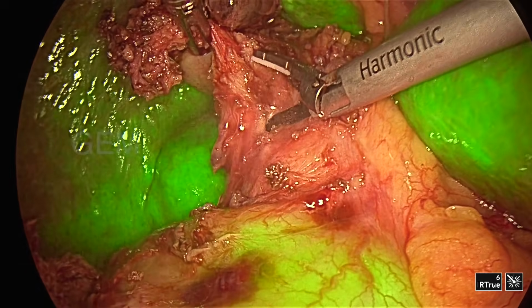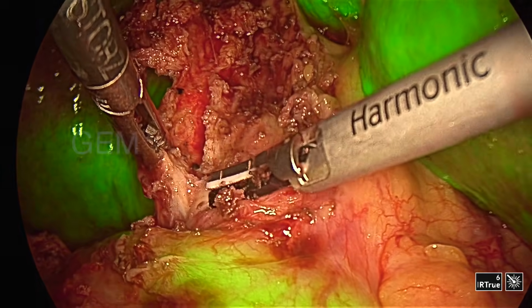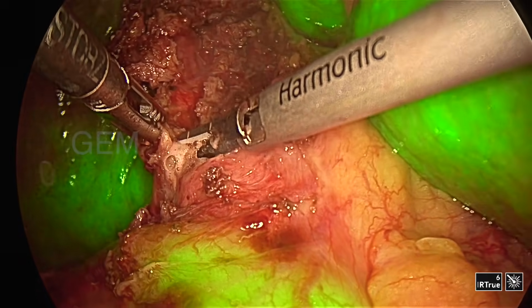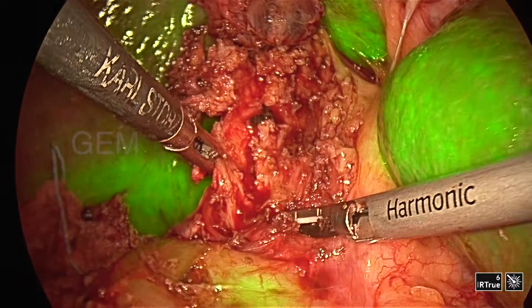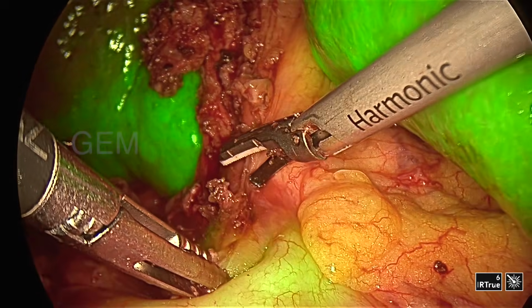I'm doing the entire surgery with the ICG mode only, overlay mode. So again I'm mobilizing the duodenum down.